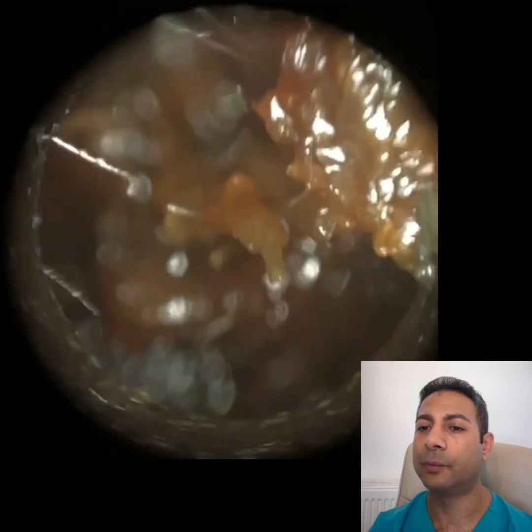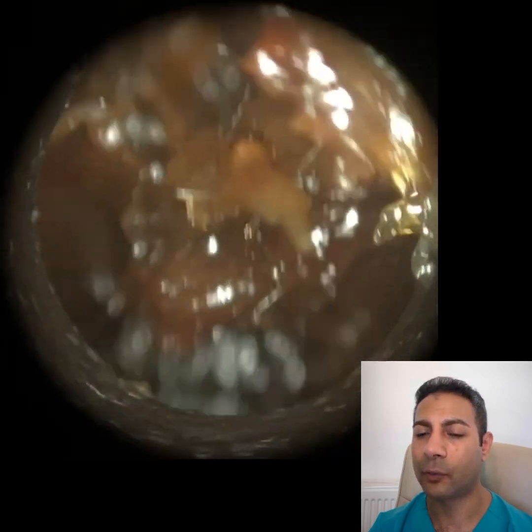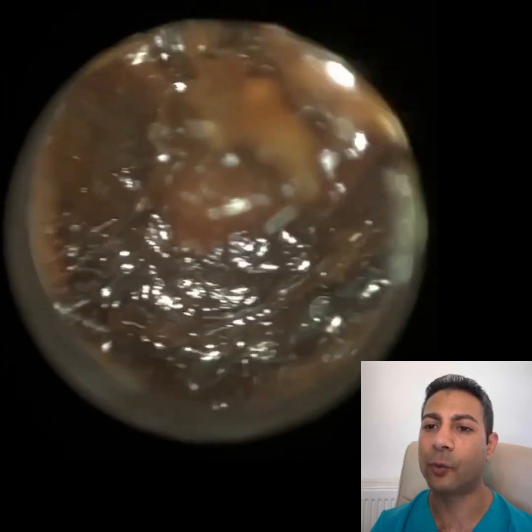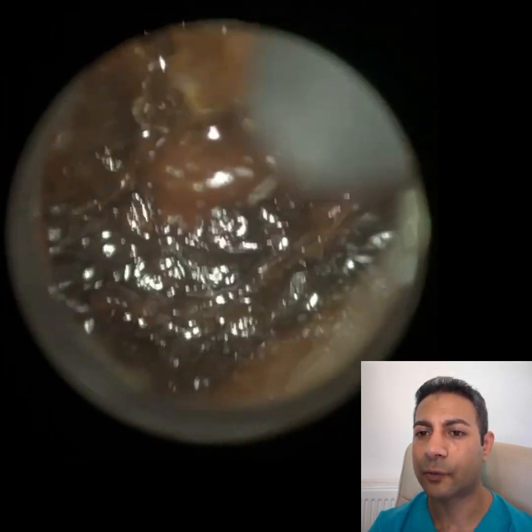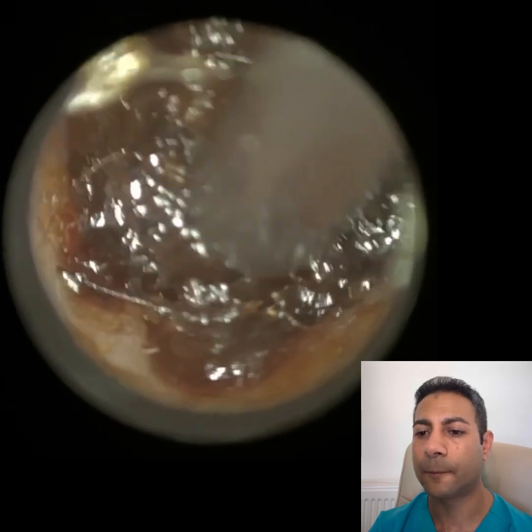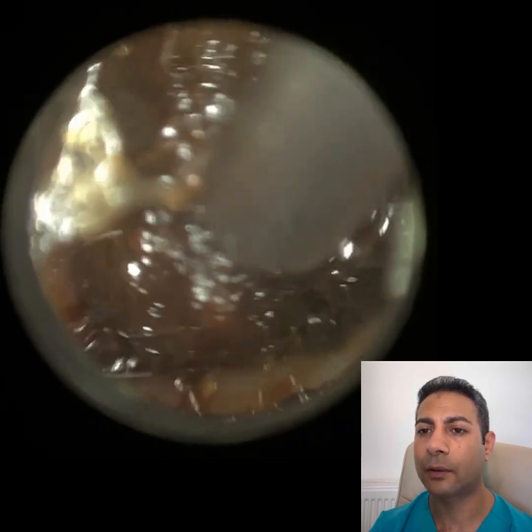And then this final plug is probably a third of the way in, so we're just going to get that in focus. We know this wax has been in the ear for a while because of its colour. It's quite dark, it's oxidised. And we're slowly going to tease this away.